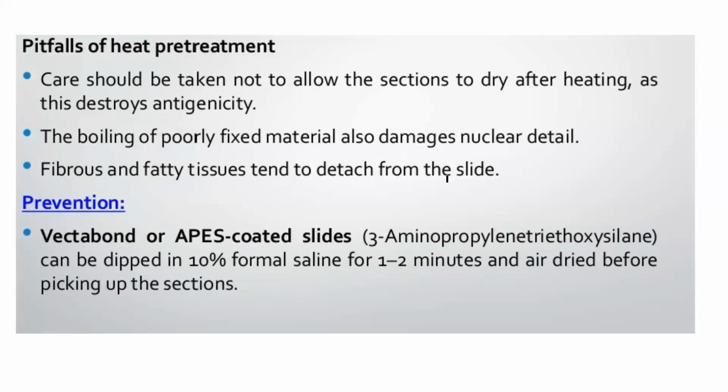Overheating or under-heating can permanently damage the tissue. If the tissue is permanently damaged, it will be a real challenge to get another biopsy from the patient. The patient is not ready to undergo repeated surgeries just for the diagnosis. So all sections are precious.